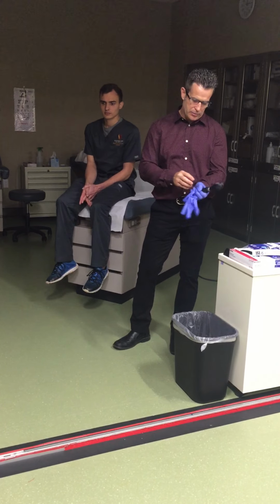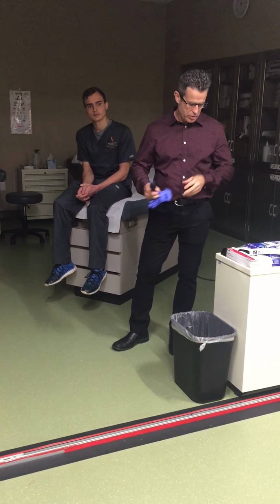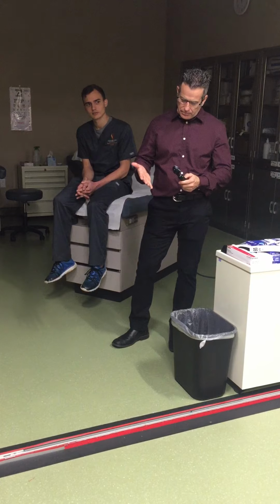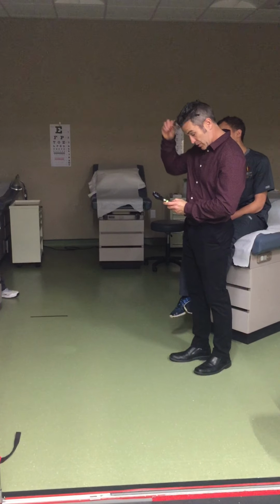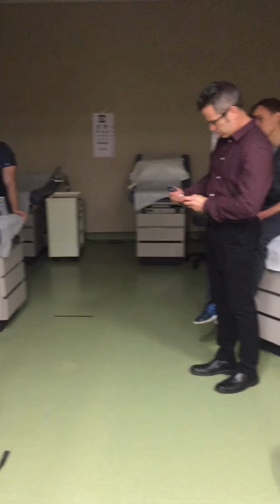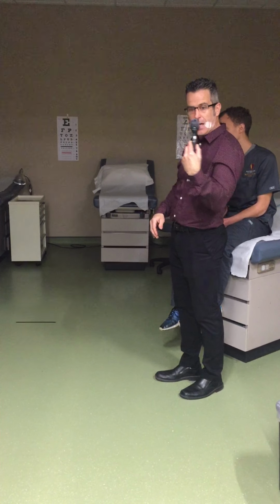And I really don't need my gloves after I get through inspecting the eyes, so go ahead and take those gloves off. I just didn't. I should have. So I want to find something about 10 foot away. So I'm going to look over here at the hand sanitizer box. I'm going to put my diopter at 0. So it's at 0. It'll be white.